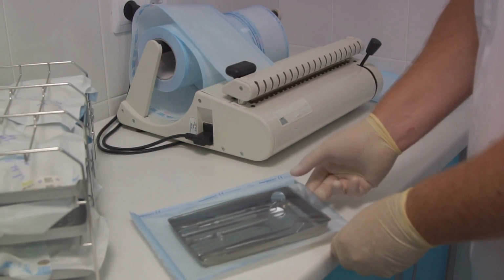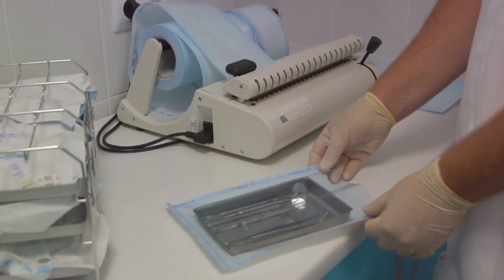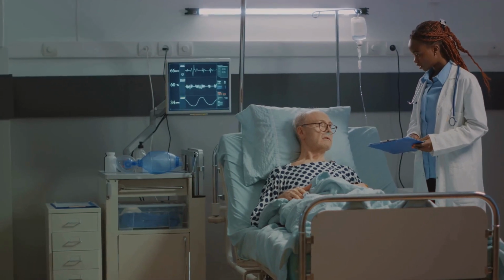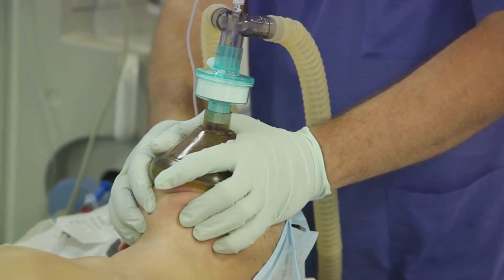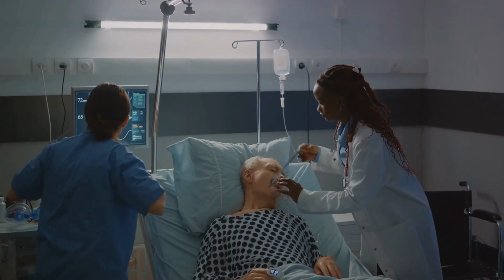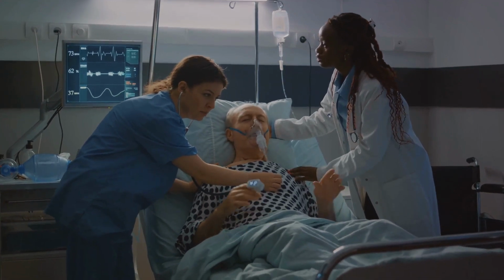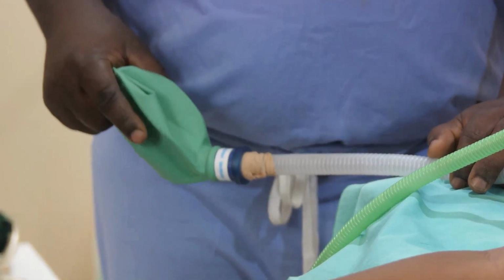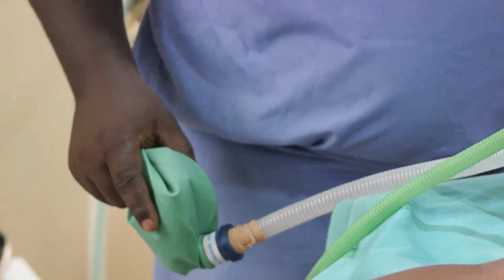Speaking of complications, it's worth noting that while nasotracheal intubation is generally safe, it's not without risks. These could range from minor issues like nosebleeds or sore throats to more serious ones like sinusitis, otitis media, or even a perforated nasal septum. There's also the risk of incorrect tube placement, leading to inadequate ventilation or damage to the respiratory tract. Additionally, it's important to remember that nasotracheal intubation requires a higher level of skill and experience compared to oral intubation. This is particularly true for fiber optic intubation, which requires a good understanding of the nasal anatomy and the ability to navigate a flexible fiber optic scope.